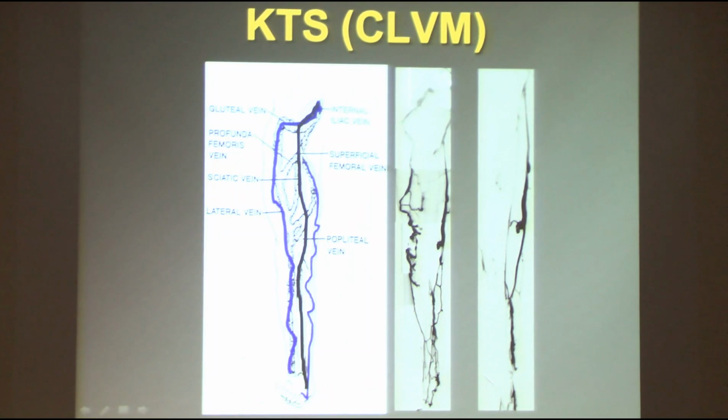All right, another example showing that you can have a marginal venous anomaly here and also have abnormal saphenous vein. So here we have a marginal vein, big varicosities around the knee, big connector gluteal vein, and then also very abnormal saphenous vein and a relatively small femoral vein.